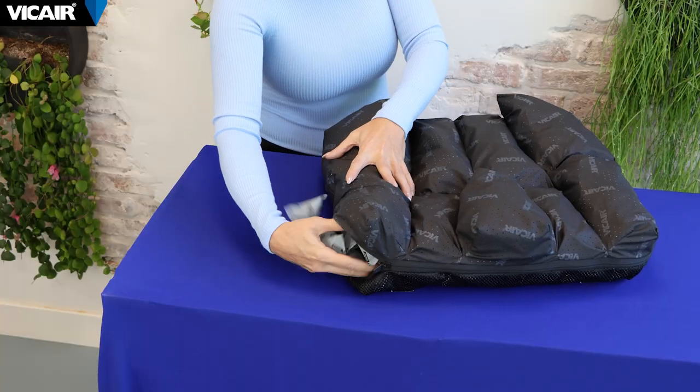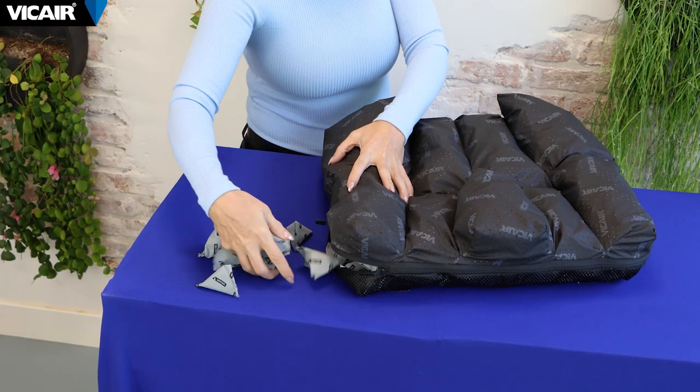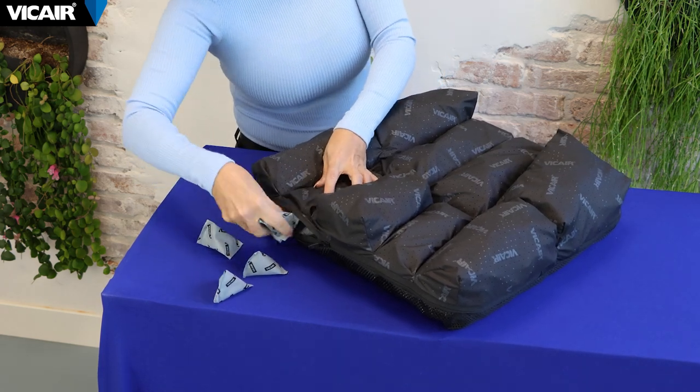Then we work towards the front of the cushion so the femur can extend, accommodating the individual range of motion of the hip joint. To do this we remove 10 smart cells from the front side compartment and five smart cells from the front compartment below the femur.